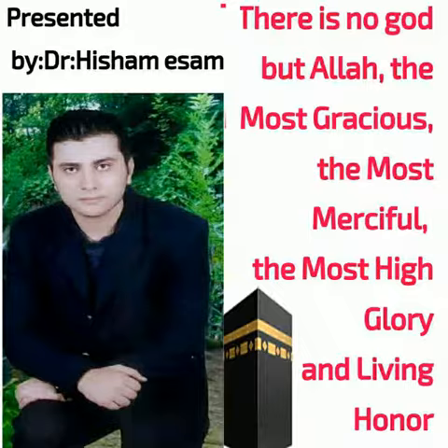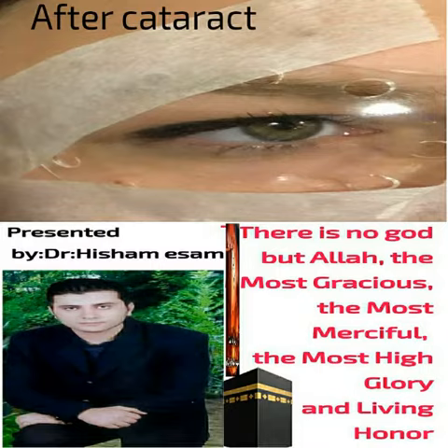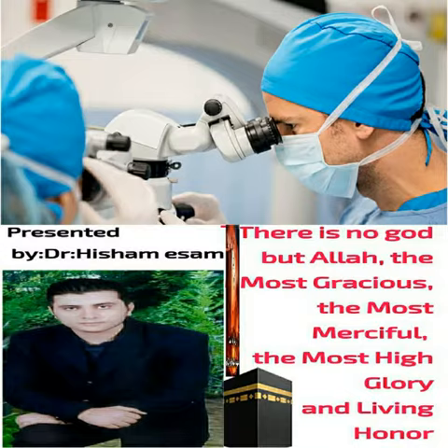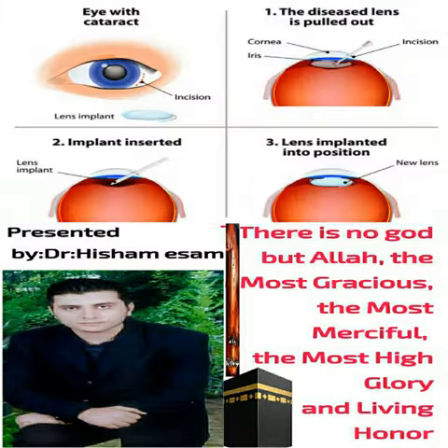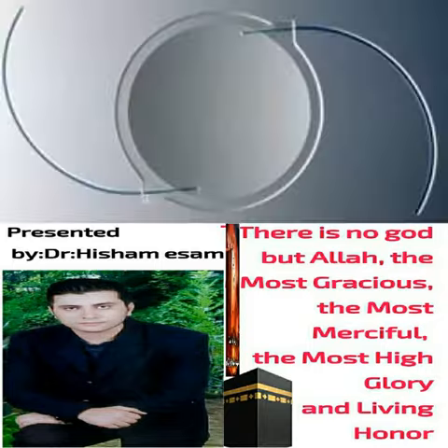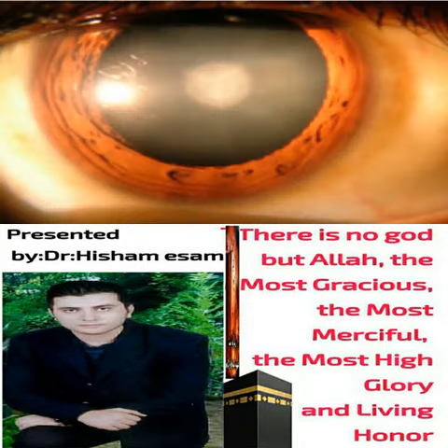Your ophthalmologist will examine your eyes to make a cataract diagnosis. This comprehensive eye exam will include dilation, which means that eye drops will widen your pupils. A patient undergoing a slit lamp examination — your ophthalmologist will use this to assess the eye.